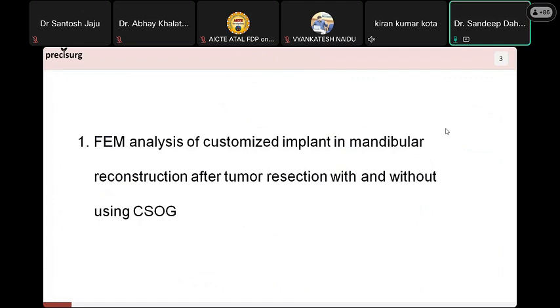You can see first he showed this to some doctor, and the doctor fitted pins in the 2nd, 3rd and 4th fingers. Those pins are called K wires or Kirschner wires. But these Kirschner wires did not solve the problem.